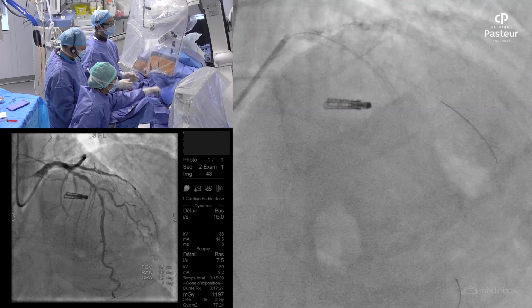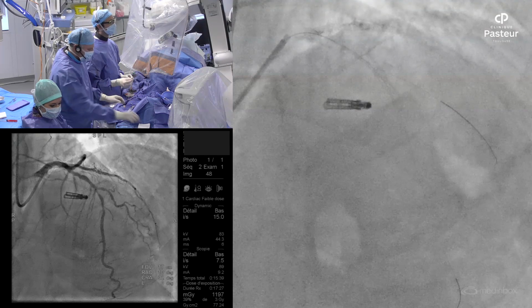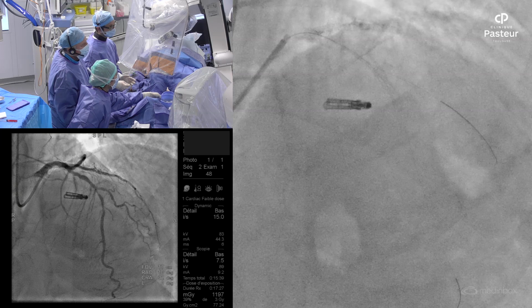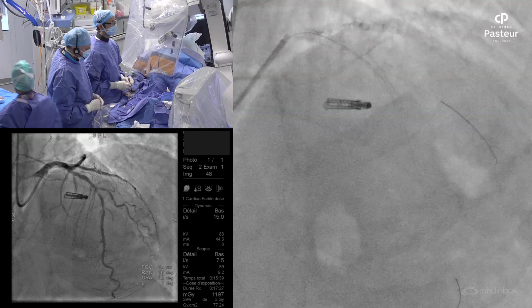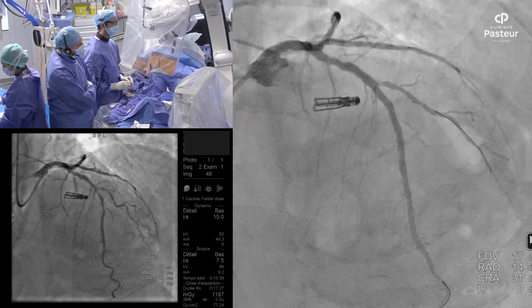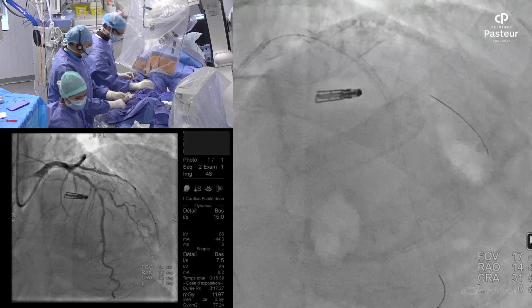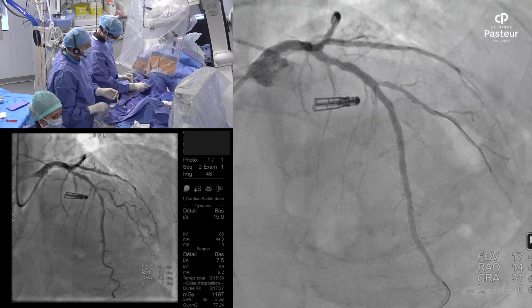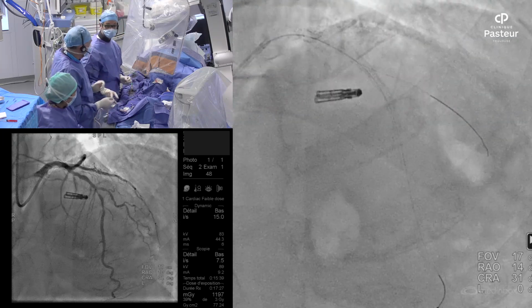I think it's important, especially if we want to avoid malexpansion of the main stent after dilatation of the side branch. So I like to do kissing, with non-compliant balloons, which is sometimes tricky to get into the side branch, especially on calcified lesions. But I always go for kissing when I want to open the struts on the side branch. I think actually there is no clear answer about the sequence of doing side branch then re-POT. What we know is, if there are two stents, kissing is mandatory. There is no question about that.